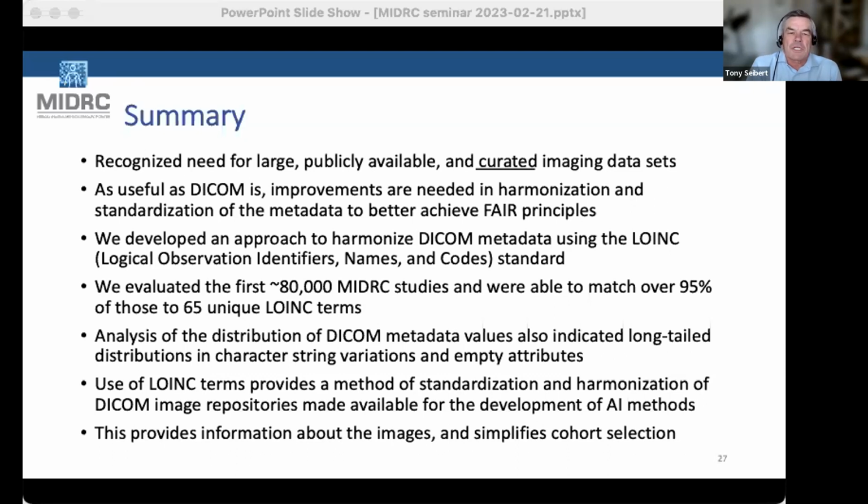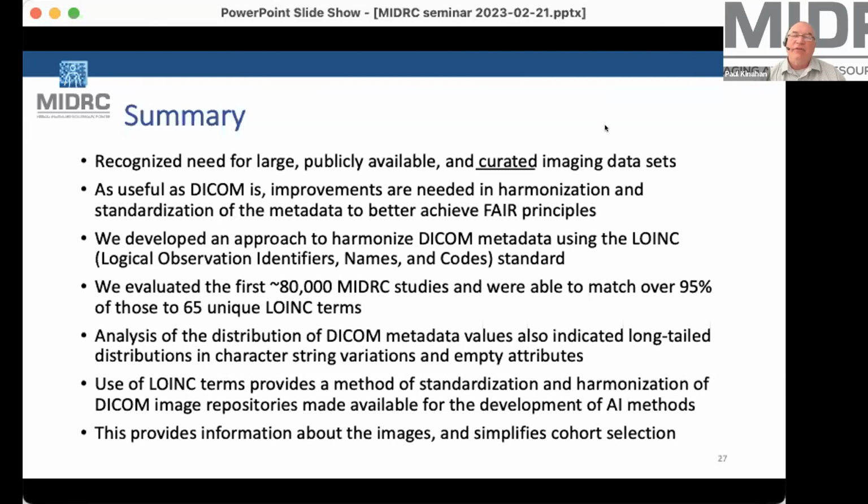Another question: at what stage is the PHI de-identified in the workflow? That's a good one, and it was in one of the diagrams I flew across, but actually it's at multiple stages. So first, when it leaves the site, by whatever means that their IRB or their local team is using, and then it comes in through either the RSNA or the ACR.